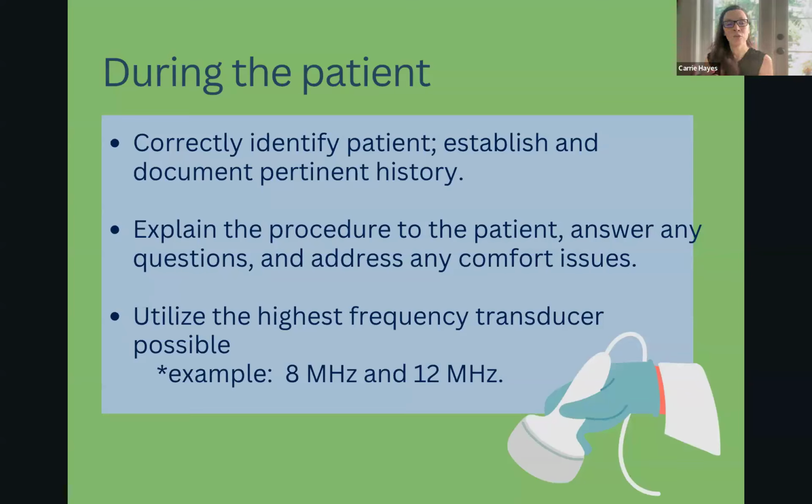So during the patient, make sure you've got the right patient. Make sure that you've established and documented pertinent history so you know this patient going in, especially in regards to prior access, because it can get really confusing in there. And explain the procedure to the patient. Let them know what you're doing.